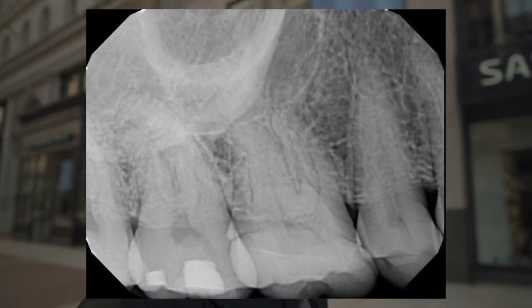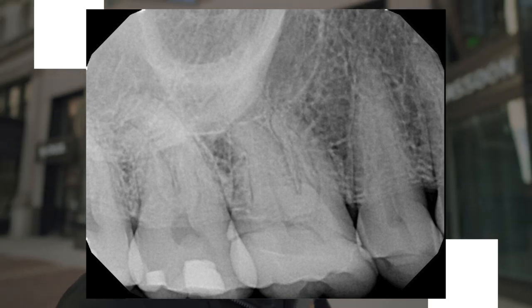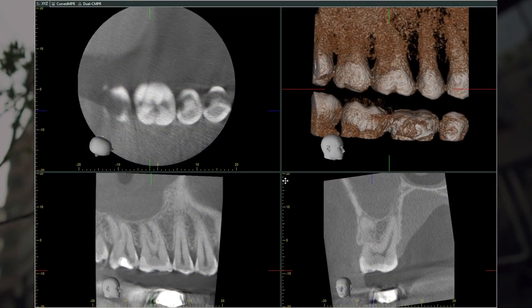This patient was diagnosed with necrotic pulp and acute apical periodontitis on tooth number three. After vitality testing, the tooth was non-responsive to cold and was positive on percussion.